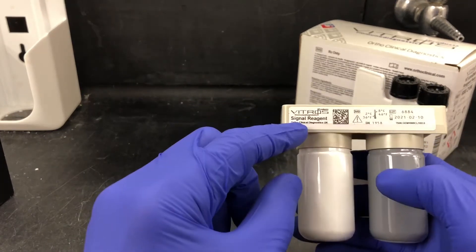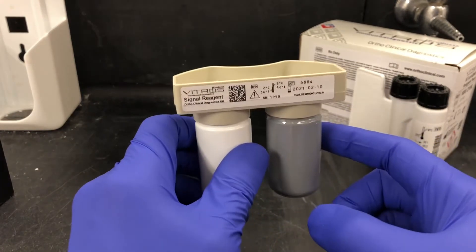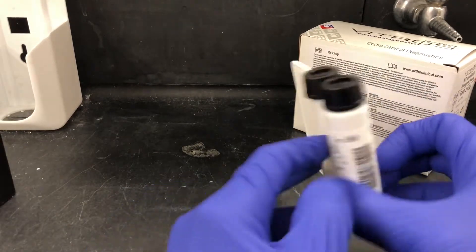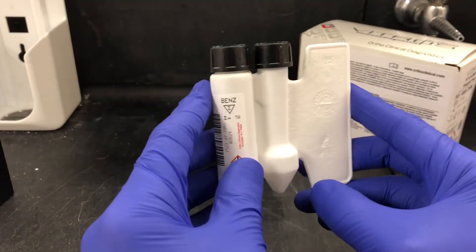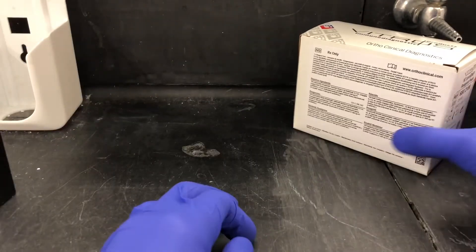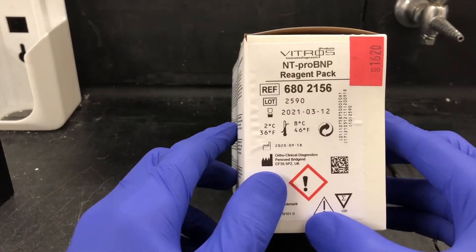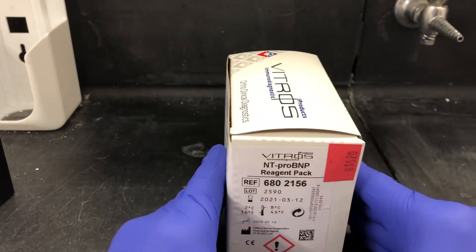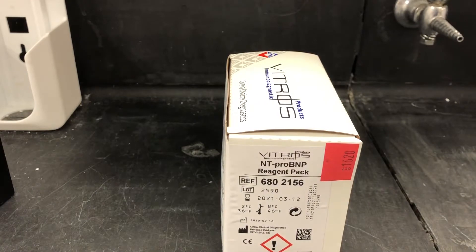We also have some signal reagent — this can go straight on from the refrigerator. The same thing for any of the micro-tip packs: they come out of refrigeration and can go on the analyzer right away. The same is true for the immunoassay reagents; they come out of the refrigerator and can also go on right away.